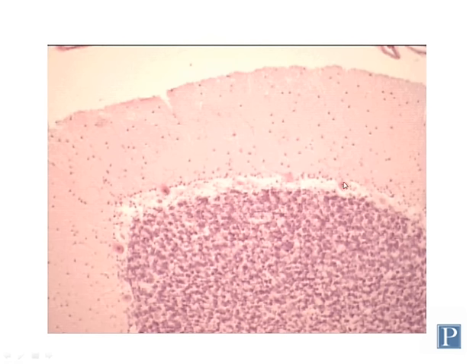These are very large cells, so their cell bodies are much larger than many other neurons in this region. But this is only showing you part of the neuron. In fact, much of the cellular structure of these Purkinje cells is not really visible using an H&E preparation. Their dendritic branches go all the way up through this molecular layer, and that's what most of this tissue is, which is really not visible. It just kind of looks like a solid eosinophilic mass. But in fact, these are mostly dendritic processes of these Purkinje neurons in the molecular layer.